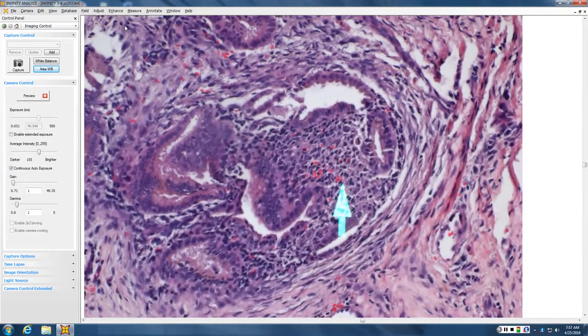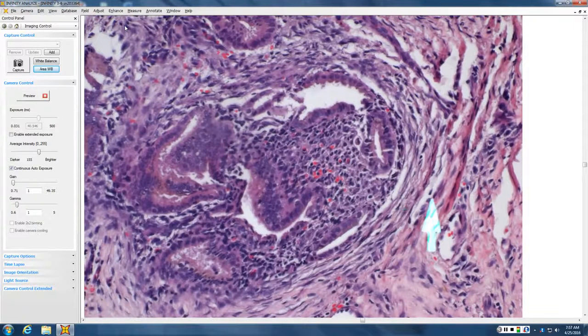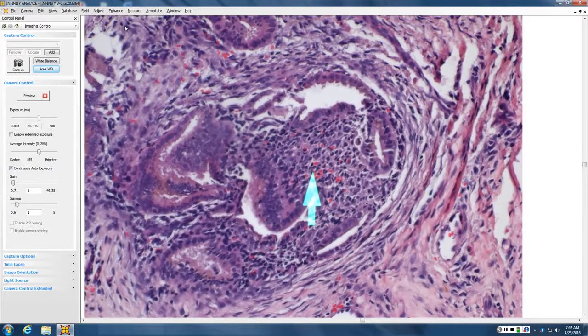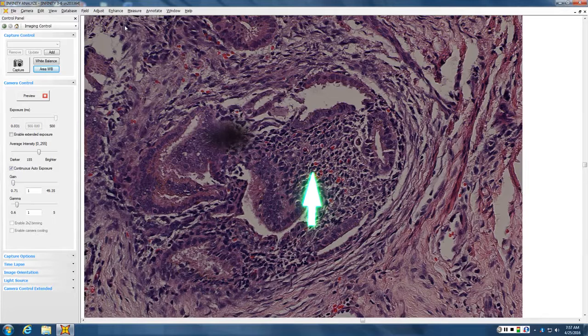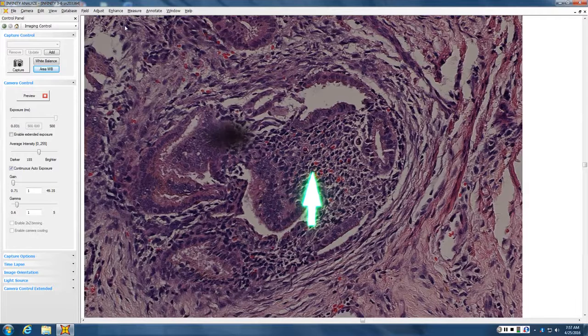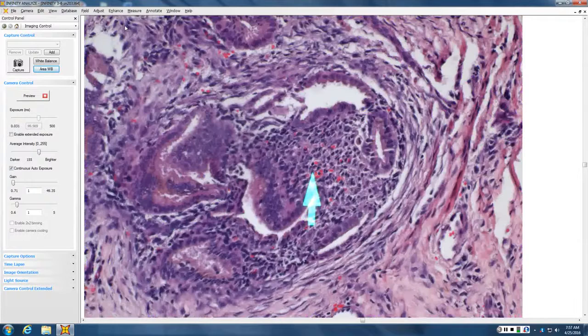The key is then that stroma. It's often a concentric fibromyxoid stroma. You see that at the edge. It tends to be somewhat cellular. And then it has lots of erythrocyte extravasation, and if you flip down your condenser, you can often make out some refractile hemosiderin in there, because over time they get hemosiderosis from that red cell extravasation.